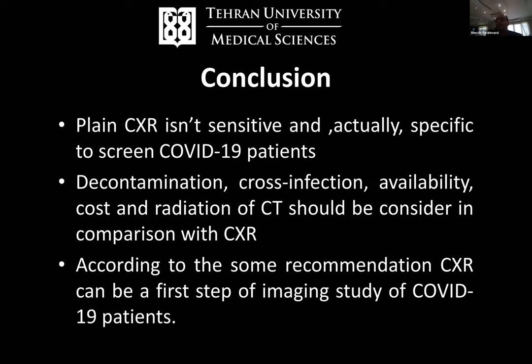In comparison with chest X-ray, we have to compare the cost and benefit of the usage of CT scan. According to some recommendations, in the first step, as a first modality to study a patient, we can use chest X-ray. But we have to confirm our diagnosis in the next steps with other modalities like chest CT scan, and we have to confirm the disease with another diagnostic modality like RT-PCR.